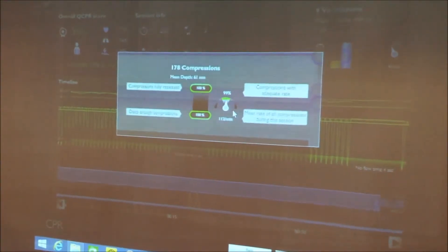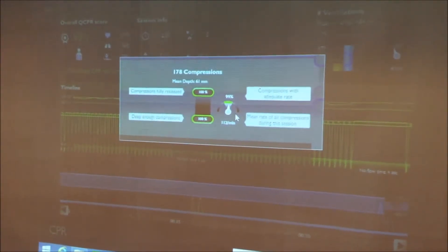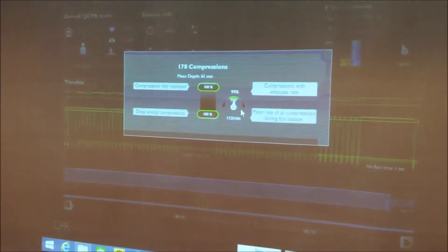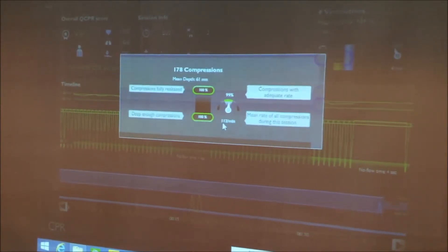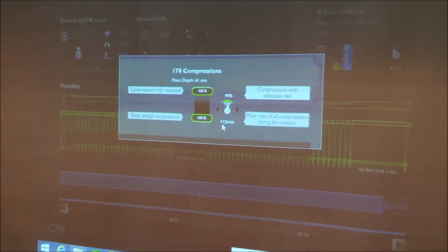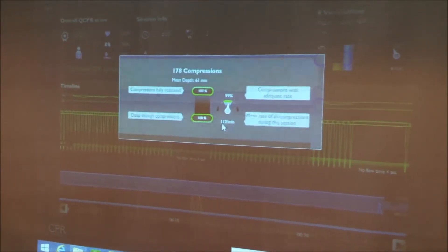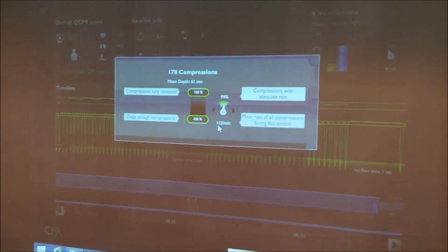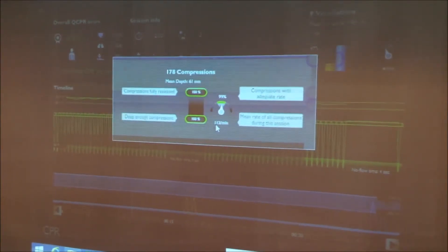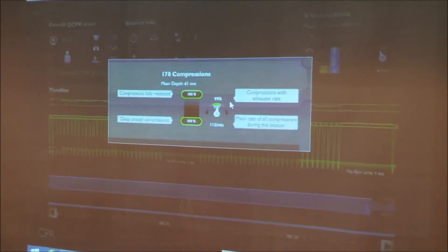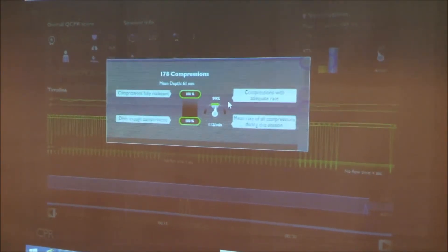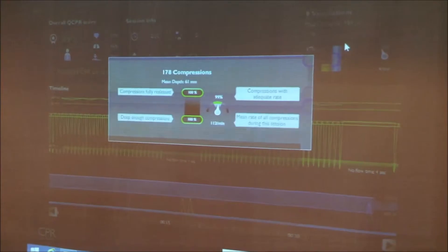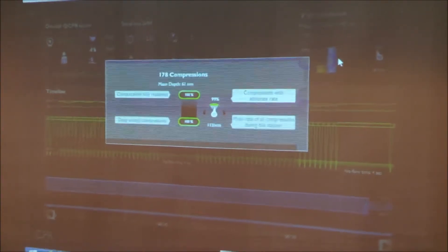And this performance indicator here is fantastic. I mentioned at one point in one of our videos that the ARC guideline is a minimum rate of 100 per minute in terms of compressions. This person achieved 112, which is fantastic because current global research is telling us that a rate of around 115 compressions a minute is delivering far greater survival in patients. And up here, the 99% represents compressions with adequate rate. This is why this person scored so well in the software, because that is an absolutely crucial indicator.